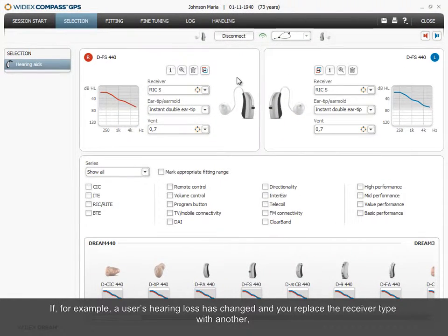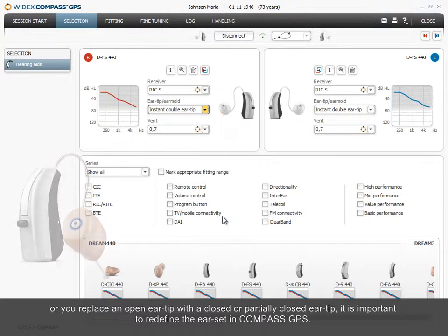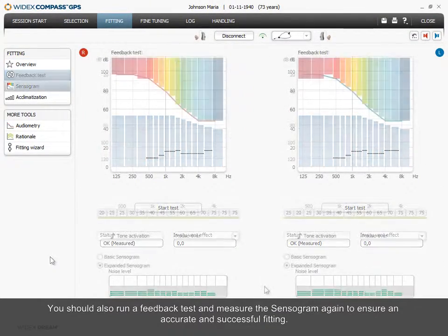If, for example, a user's hearing loss has changed and you replace the receiver type with another, or you replace an open ear tip with a closed or partially closed ear tip, it is important to redefine the ear set in Compass GPS. You should also run a feedback test and measure the sensorgram again to ensure an accurate and successful fitting.